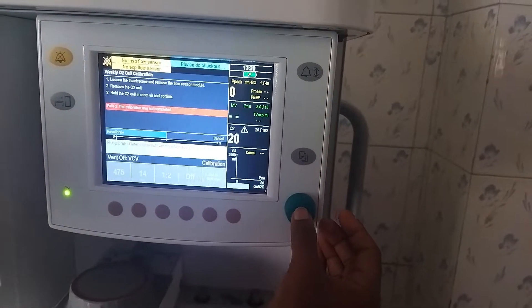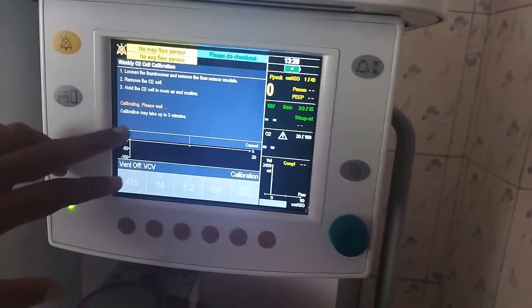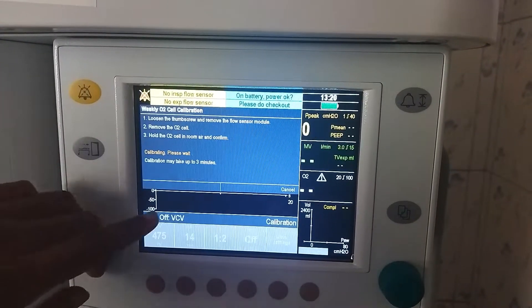Now we do recalibrate. It is now calibrating — it will take up to 3 minutes to complete.